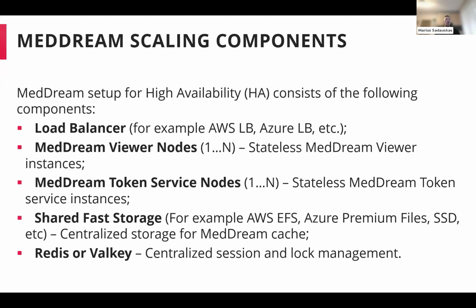What else you need? Of course, the MedDream Viewer nodes in the stateless mode, and the token service if you are planning to use the secure URL integration. So this one also is required, and the shared fast storage. It would be a centralized storage for the MedDream cache.